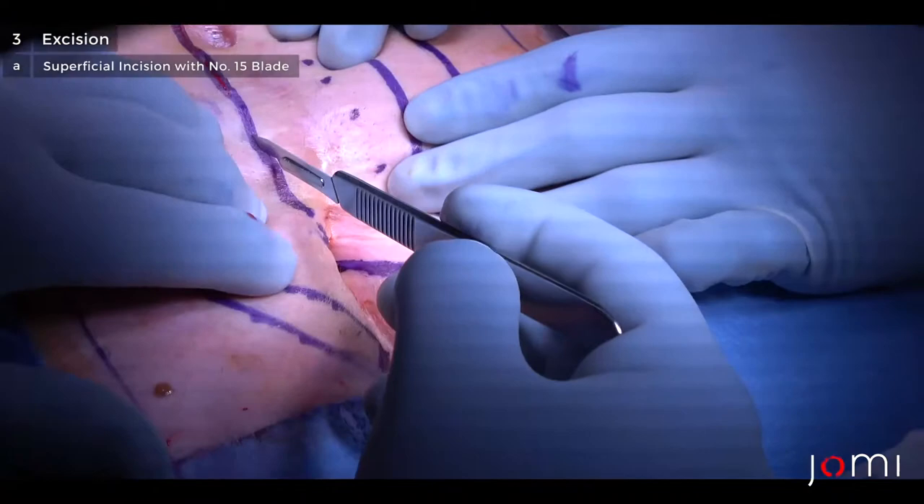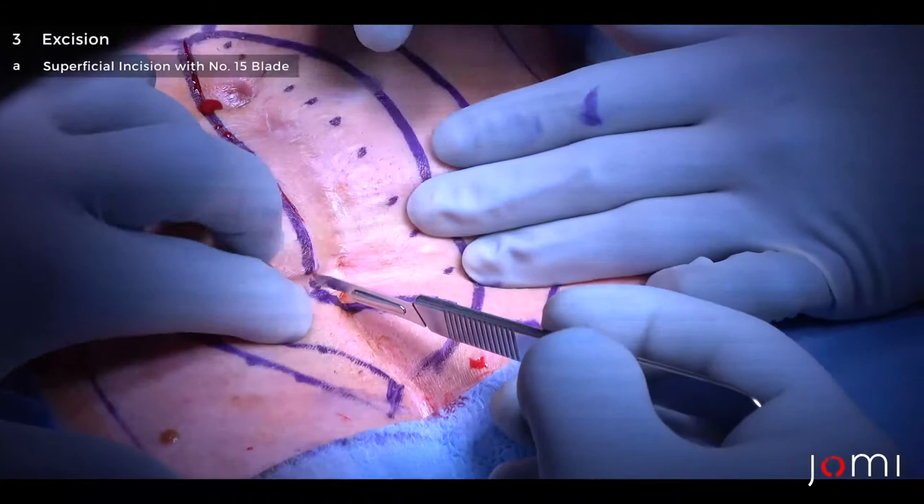The incision is always created so there's as close to an ellipse as possible, and the ellipse is always staggered off the midline so that the final product will be an incision that's off midline.